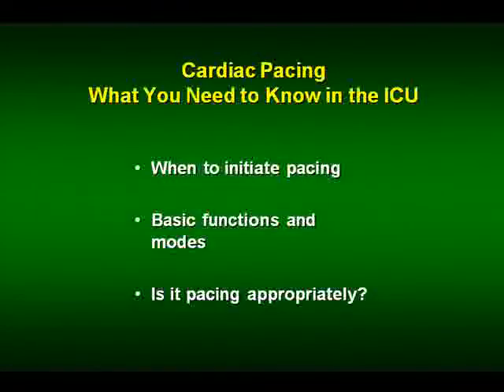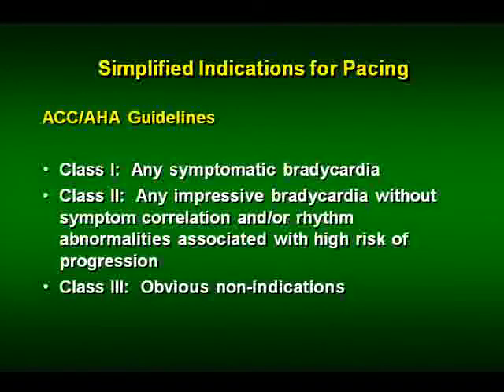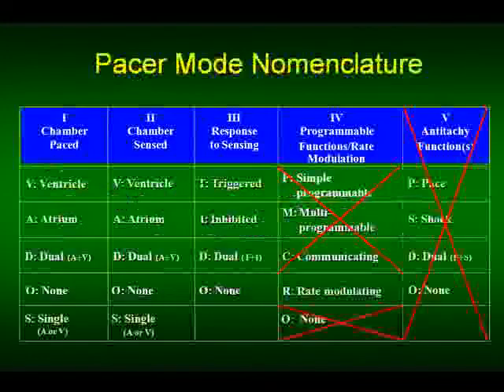What do you need to know about pacing? These are my last couple of minutes here. It's not really VT, but you need to know when to initiate pacing, what the basic modes and functions are, and can you analyze a pacemaker strip. The simplified indications for pacing: if your heart rate's too slow and you have symptoms related to the bradycardia, pace. Class 2 is, well, your heart rate's slow, but I'm not sure if it's causing your symptoms, but maybe it's associated with a high risk of progression, then you're allowed to pace. And if your heart rate isn't slow and you don't have any symptoms, or the symptoms aren't related, then you obviously don't have an indication for pacing.